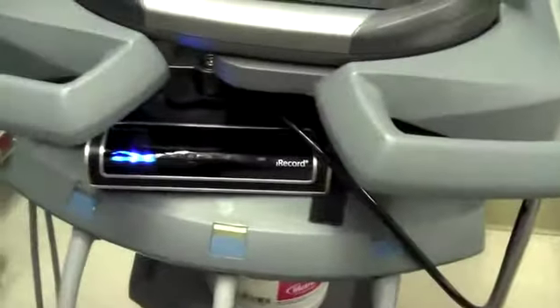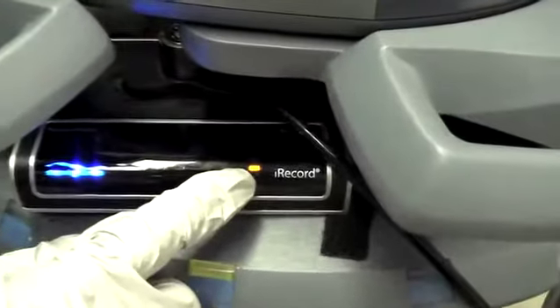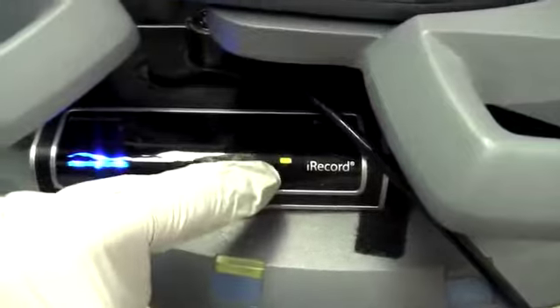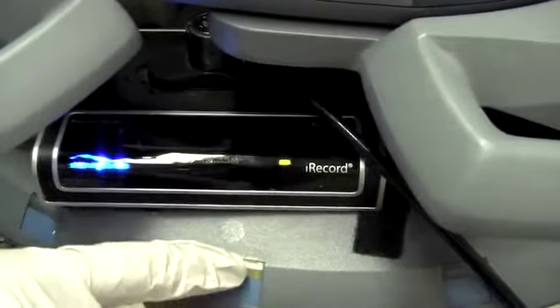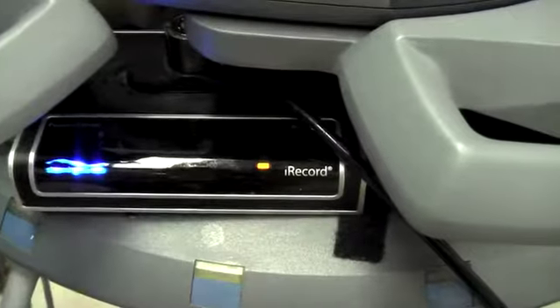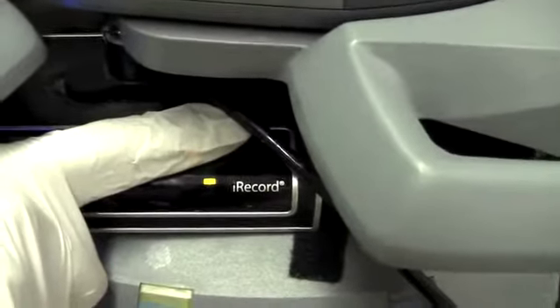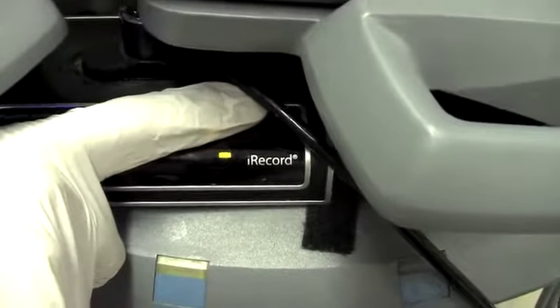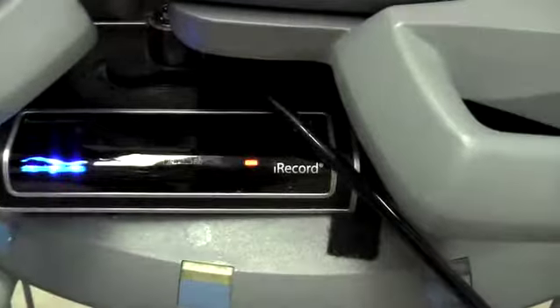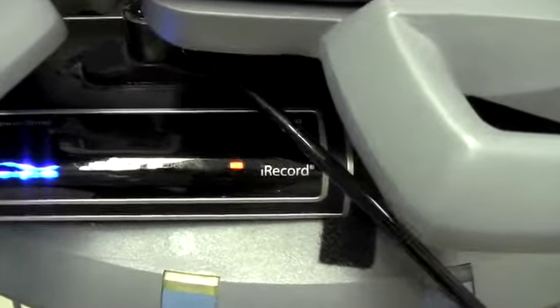This is your indicator light. When it's flashing green and flashing yellow, it's booting up. Once it turns steady green, it's ready to record. So once you've found something that you want to scan, you hit the record button. Flashing red indicates that it is actively recording. There it goes. That means everything's working fine and what you're doing is being recorded for QA purposes.